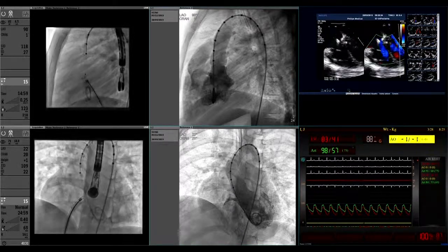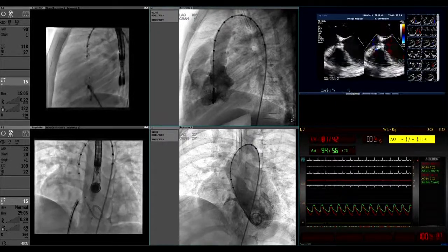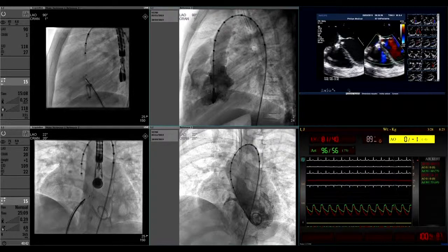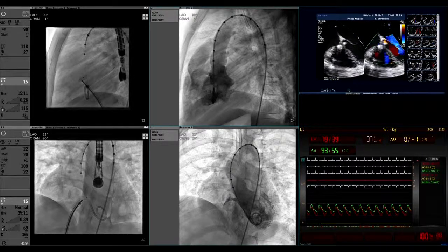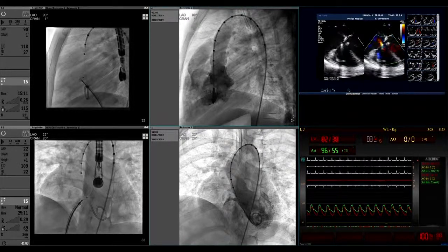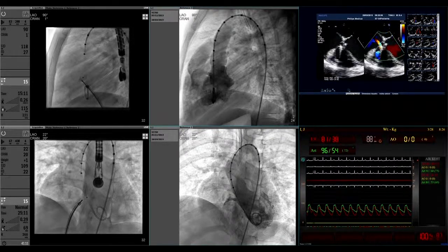Yeah, Tin. I wanted to make a point: if you look at the original angiogram, you can easily talk yourself into putting in a double disc device because you'll think there is quite a length to the tunnel, whereas the echo gives a better appearance. And again, with the current deployment, it looks as if the device could do with pulling in a little bit more in order for it to stick out into the right ventricle a little bit more. It's the length of that tunnel, really, which ultimately will determine how much you pull in or what sort of device you put in.